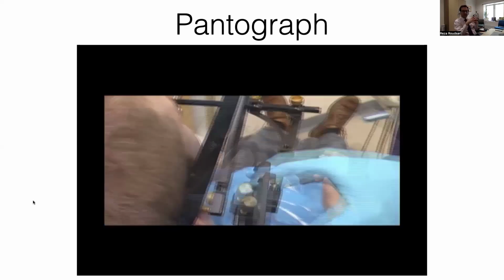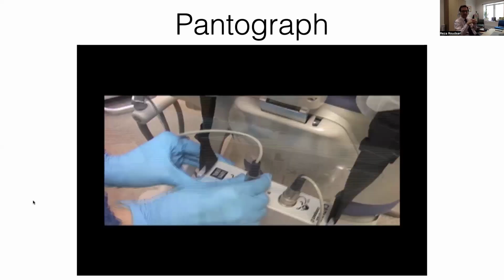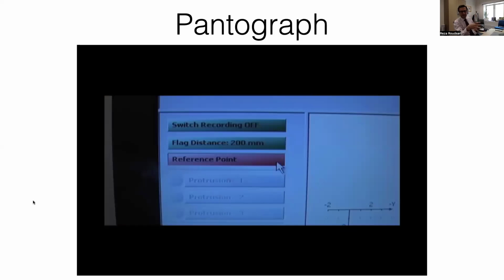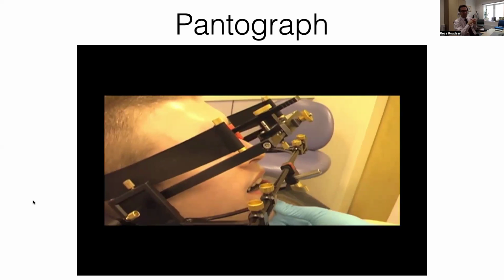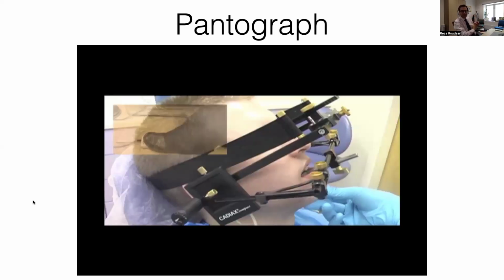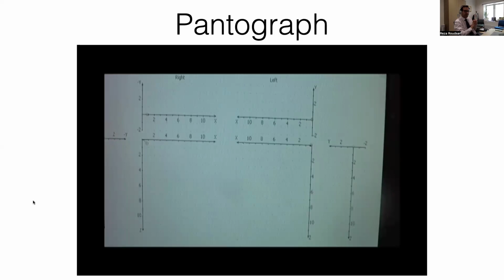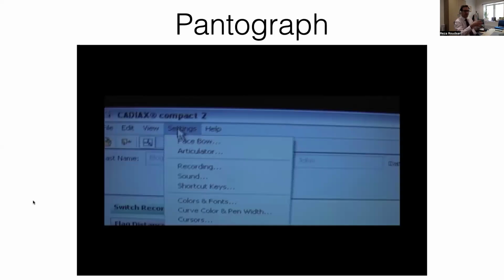And then when everything is aligned, you change your side components into the stylus and the digital recorder, which then goes to the computer, and the computer goes into your laptop, which also gives you a foot pedal. So essentially, you then ask the patient to do different positions, and as they do different positions, you acknowledge by pressing on the foot pedal. So essentially, you repeat every procedure, lateral excursions, protrusion, 3 times.